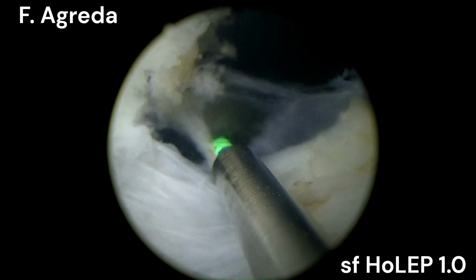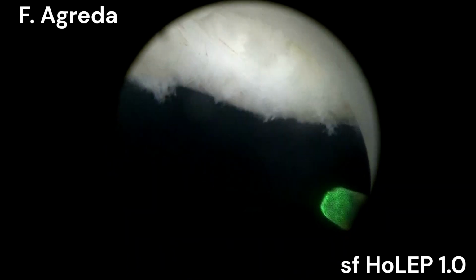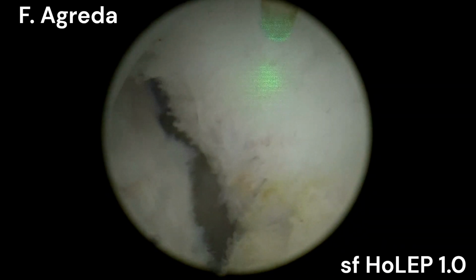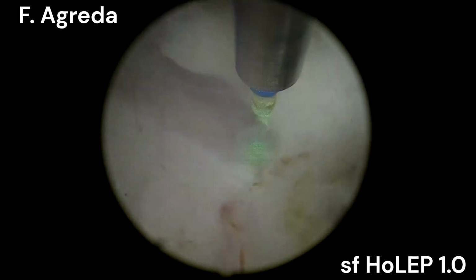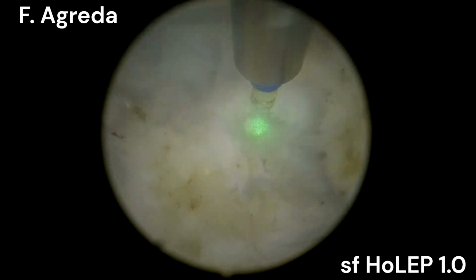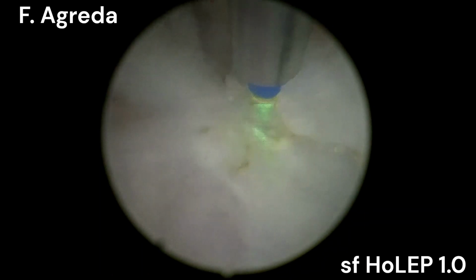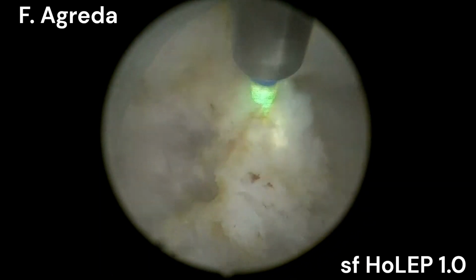So the left adenoma is already in the bladder. Of course, as it is a block technique, it's already attached by the right side. So you always have to look at what portion of capsule is attached to the adenoma, and go right through, detaching it in a progressive manner, completing your enucleation to completely release the adenoma into the bladder.